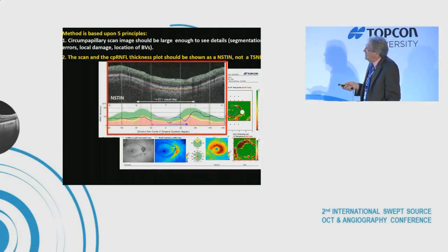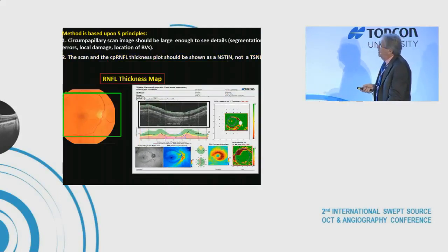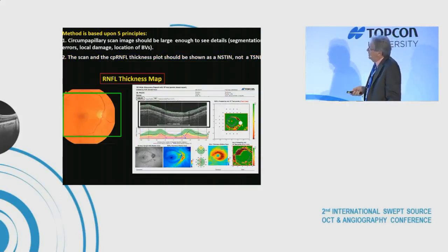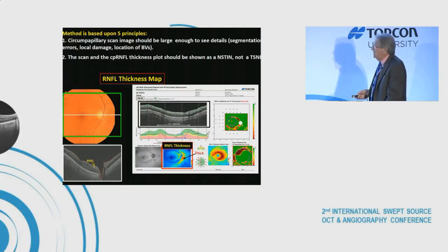In the instant plot, you can see it tells you where to look if you're searching for damage within 15 degrees, plus a nasal step, and it shows you where your macula is. The retinal nerve fiber layer thickness is shown in pseudocolor — taking a line through gives you the thickness at that location. Dark red is thick, dark blue is thin.